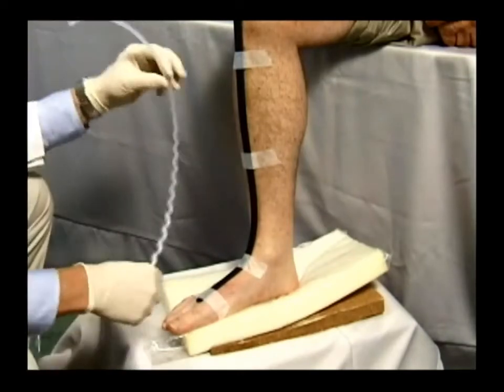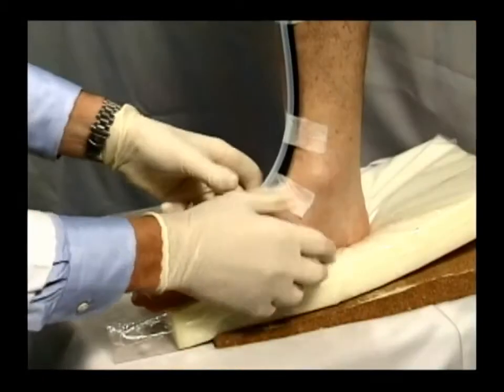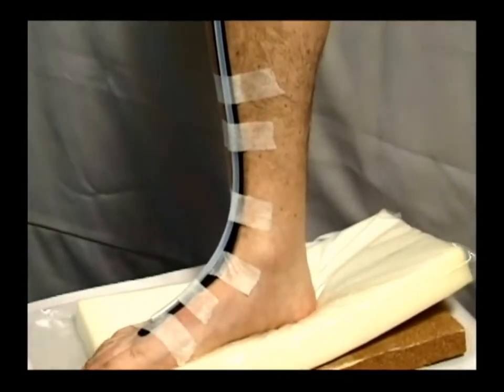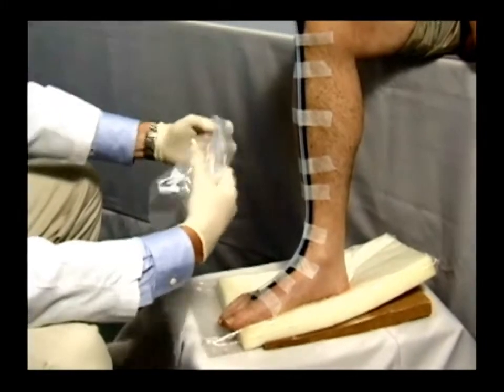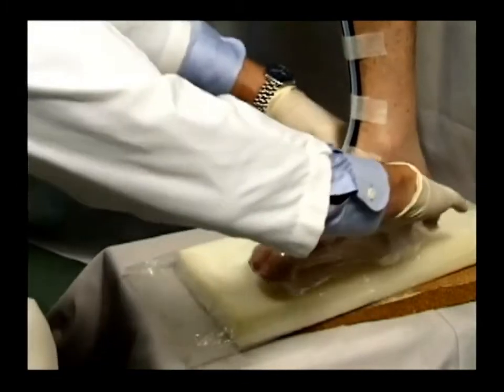Next, position the 24 inch plastic cutting tube so it is centered directly over the underlying cutting strip, and slide it back one half inch so that one half inch of the underlying strip is exposed at the distal end, just behind the toes. A small opening in the sock will be cut here later on in the procedure. Tape the tube in place in the exact same manner used to tape down the strip, trying not to apply the tape over the strips already in place. With the foot maintained at 90 degrees to the leg, carefully slip the plastic bag over the foot and lower leg, taking care not to displace the tube and cutting strip.